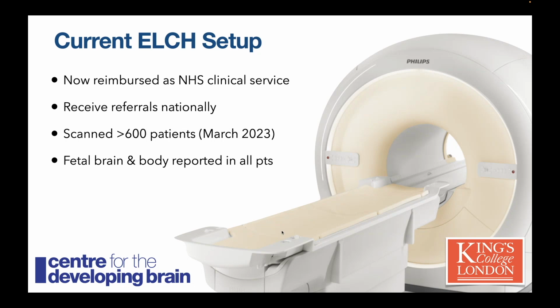We work very closely with a team here, the team that we originally piggybacked on at the beginning, actually, and we consistently get extra cardiac findings, brain and body, reported in all of our clinical patients. That in itself I think can be quite an interesting thing to think about when we're thinking about clinical utility, some of the extra cardiac findings that can be picked up by MRI.